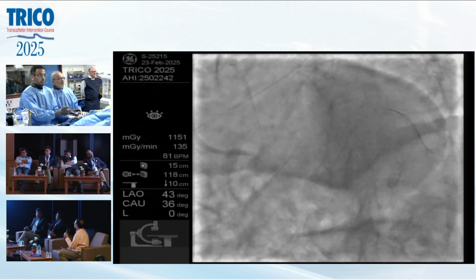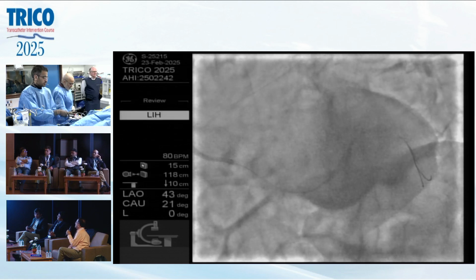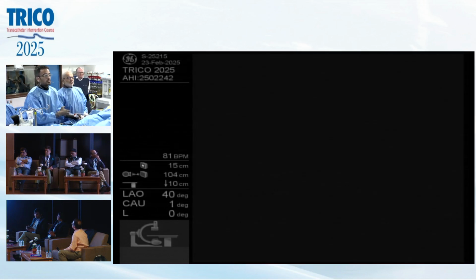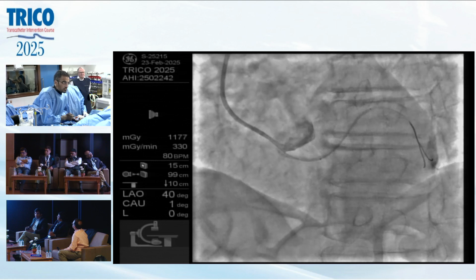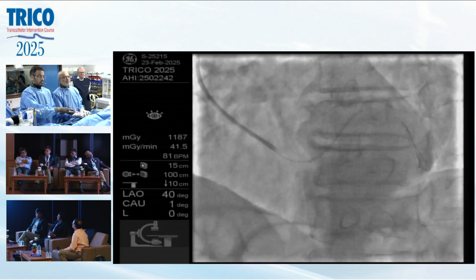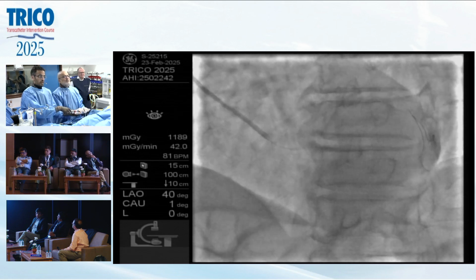Get me an LAO view. I think that is better. Get me LAO view now. It just went a little bit. Because we don't need to see that now. And let us check it in this view. Yes, it has progressed.